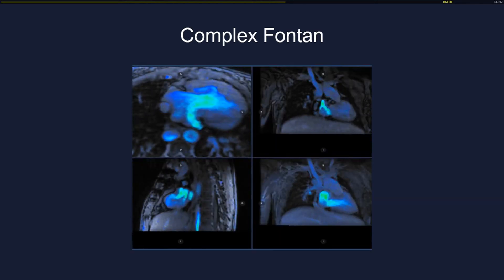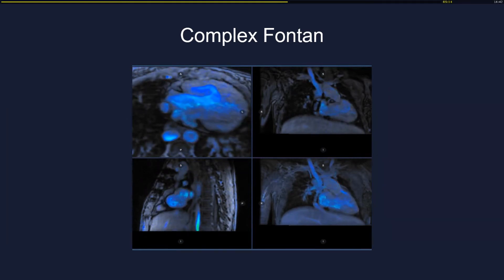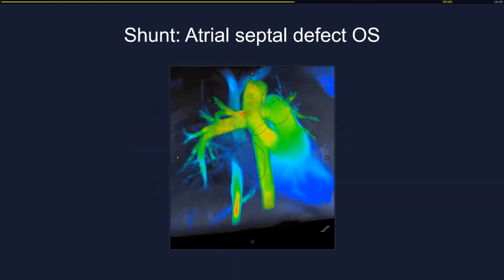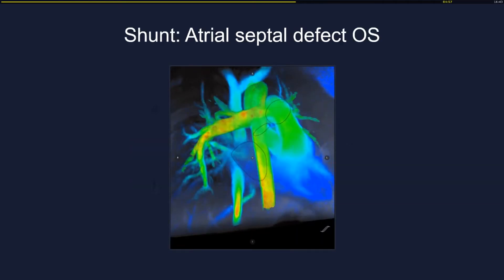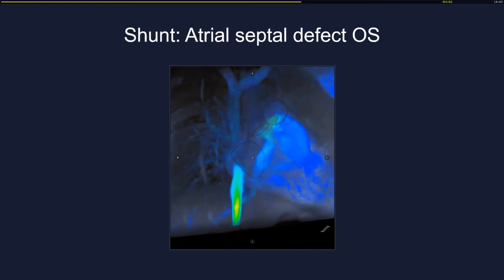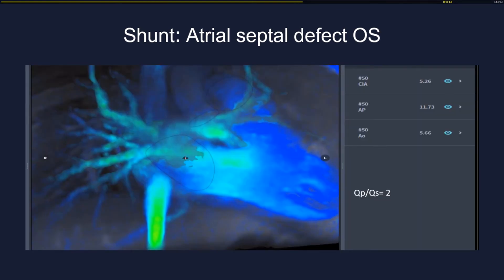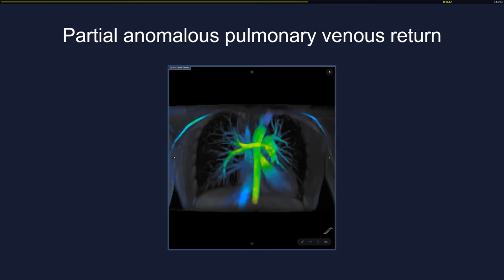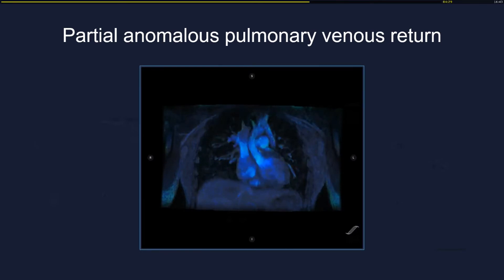In a complex, really cyanotic Fontan patient, even after percutaneous closure of fenestration, we discovered a big venous fistula with two liters per minute of stroke volume draining into the coronary sinus. Turning to simpler pathologies, we normally categorize patients to estimate QP/QS for interatrial or interventricular septal defects. With 4D flow it's really easy to calculate QP/QS. Also in partial anomalous pulmonary venous return, you can visualize the anomaly in a dynamic way that is really important for the surgeon, and calculate flow. In one patient, we discovered a second partial anomaly — the patient was supposed to have only a right anomalous pulmonary venous return, but we discovered another anomaly on the left with the right upper left vein draining into the innominate vein.